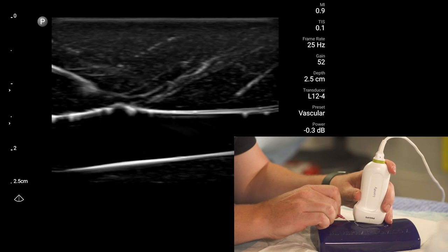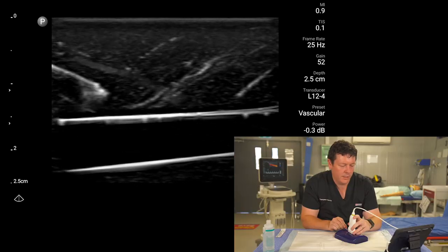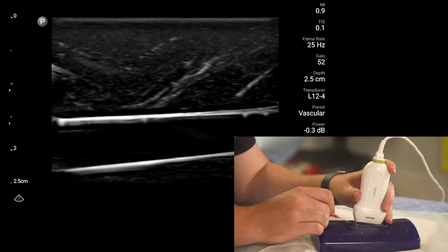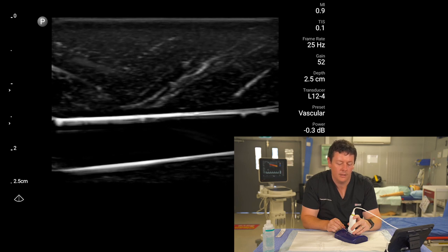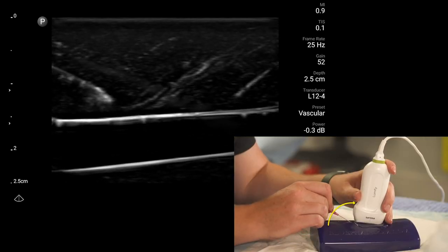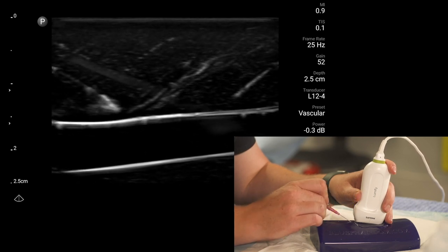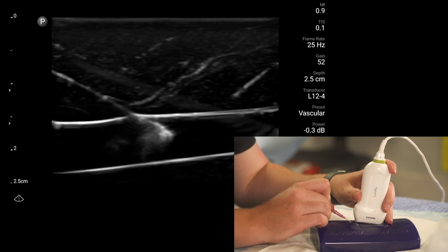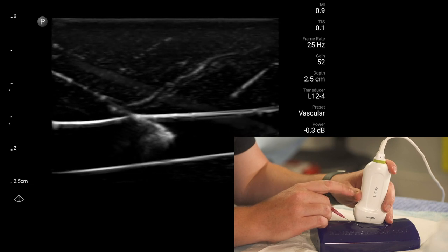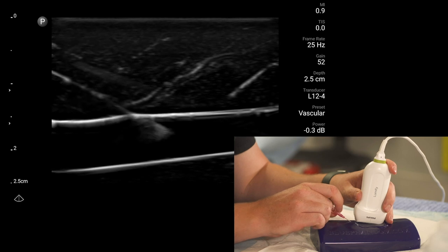If you happen to fall off target slightly, the key is to not move the probe. Keep the probe looking at the target and move the needle to find it again within the probe view. Once the needle is back in position, follow it along into the target. For cannulation, simply slide the cannula off once you're in — and you'd be fairly happy with that.